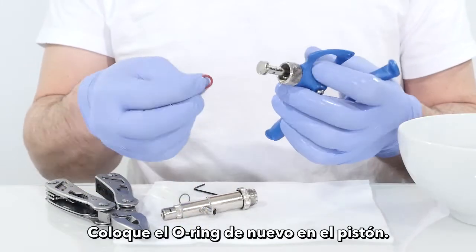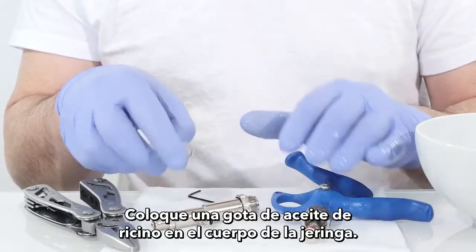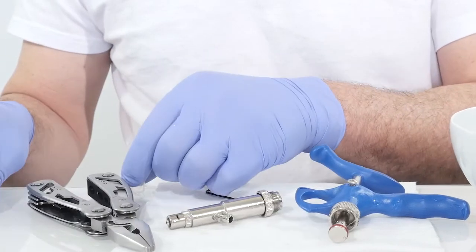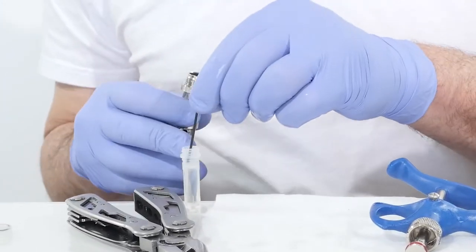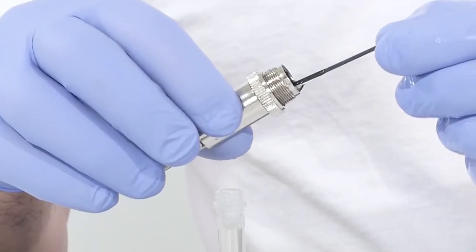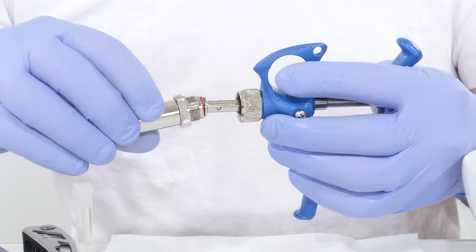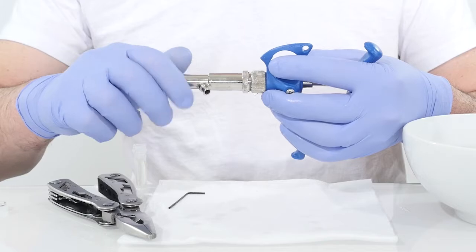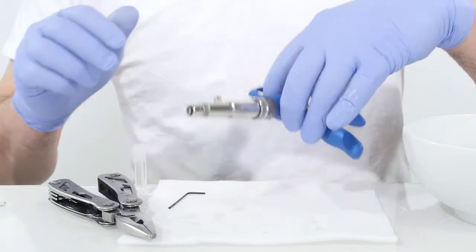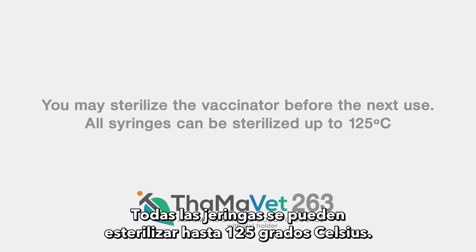Place the o-ring back on the piston. Put one drop of castor oil in the syringe body, then close the syringe body. You may sterilize the vaccinator before the next use. All syringes can be sterilized at up to 125 degrees Celsius.